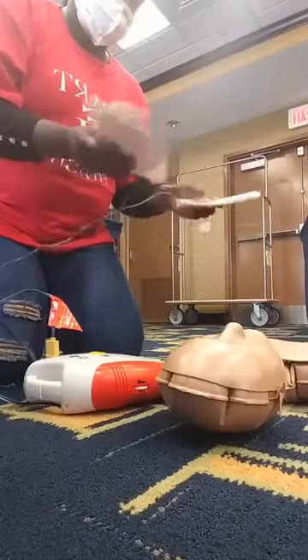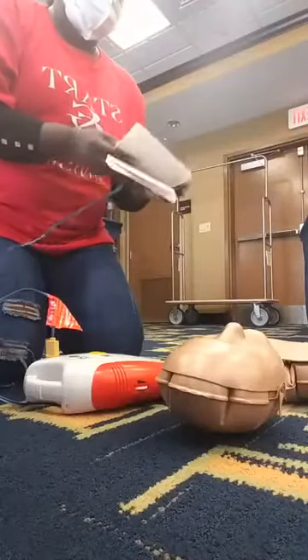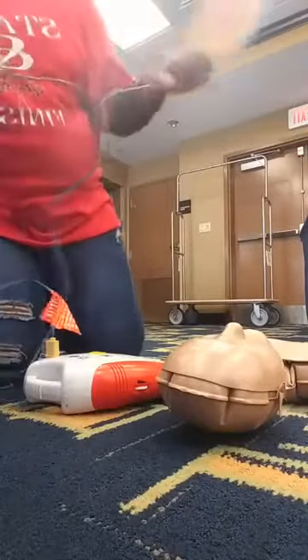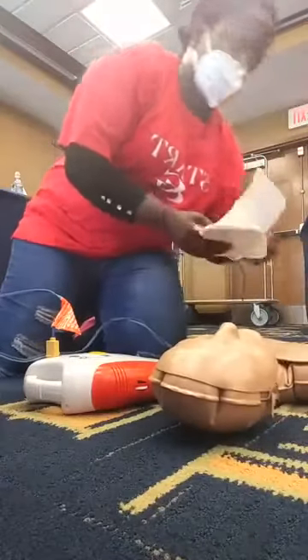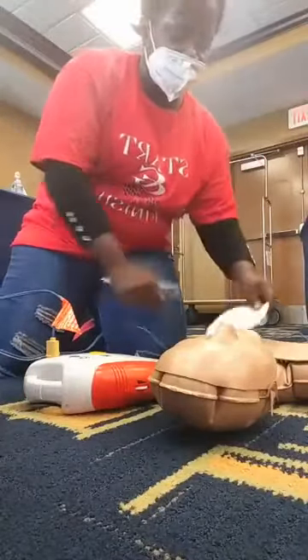And on the pads, we have adult pads here. On the pads, it'll show you exactly where to place the pads. One is going to go on the left, on the side here. And one is going to go at the top right.